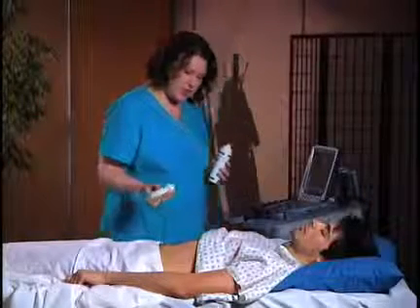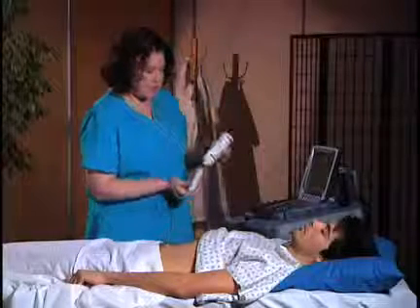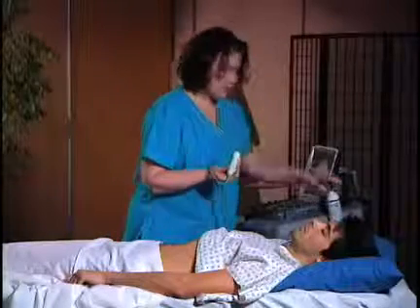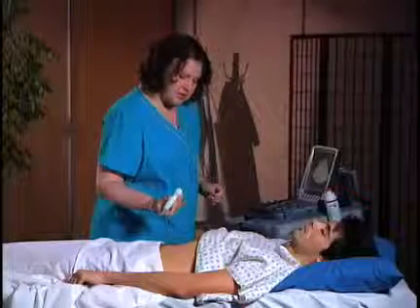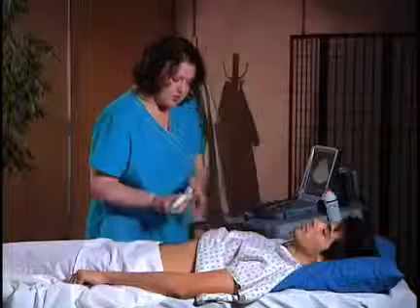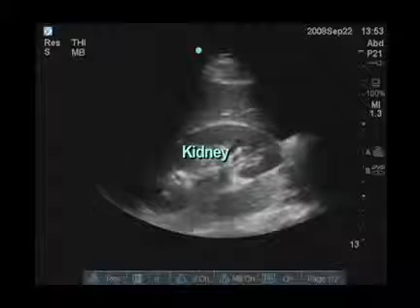The first view we're going to look at is a sagittal view of the kidney. I'm going to start on the right side, but I will do both sides to show you how to do an evaluation on both sides. We're going to go in with the orientation marker pointing to the patient's head, so this will be a sagittal view. I'm going to go in fairly laterally. With this starting point, I can quickly identify where the kidney is. In the anterior aspect of the image, you see the liver, and immediately posterior to that, you see a crescent-shaped organ, which is the kidney.